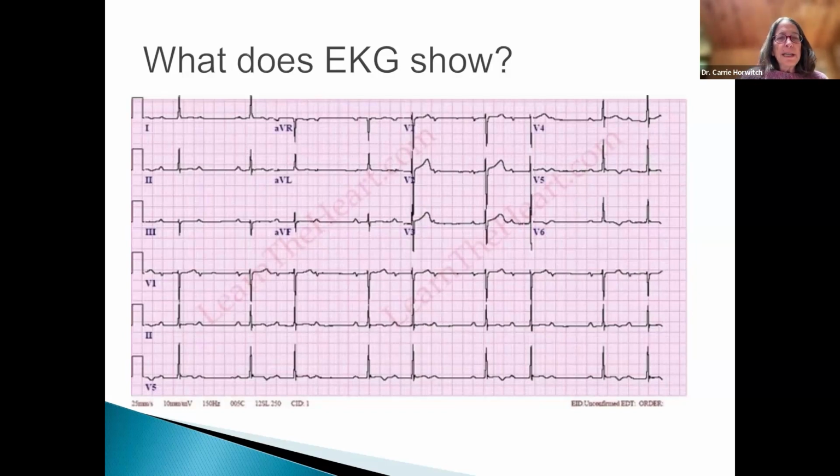If we look at our intervals, we notice some of the PR intervals are normal. They're less than one of the big boxes, and others are longer. And then we have some P's and there's sort of nothing there. So people have been saying there's some kind of heart block in here.